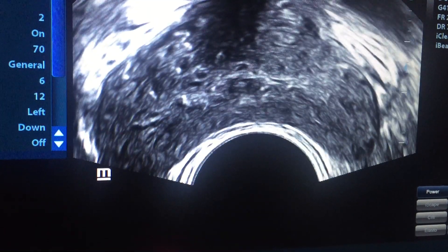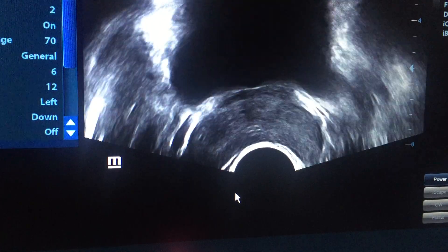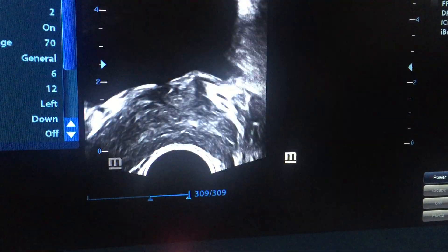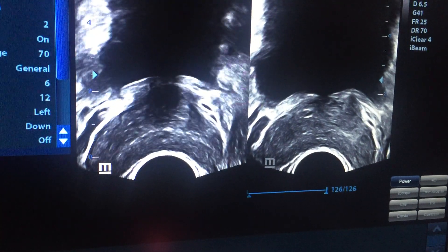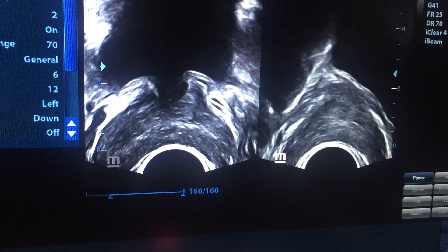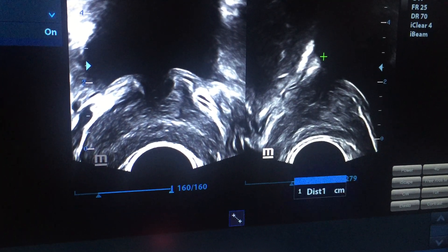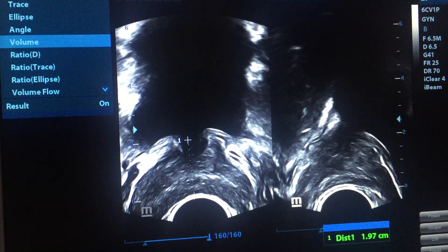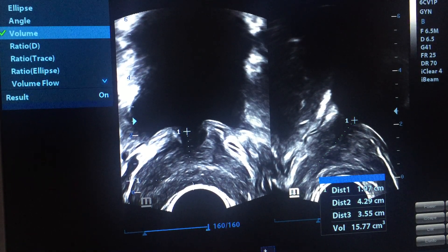Let us summarize and have an overview of the outer area. The prostate is clear. We should take the prostate size in two planes. This is the widest transverse diameter, and now we make it longitudinal. You can take the measurements like this and go to the volume calculation. The volume is 15cc, which is good for this age group of approximately 30 years.